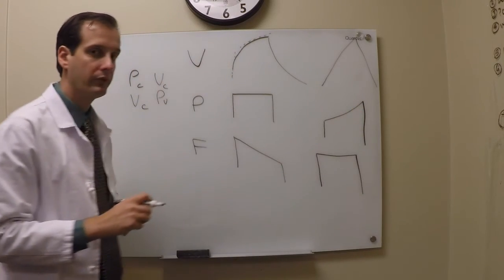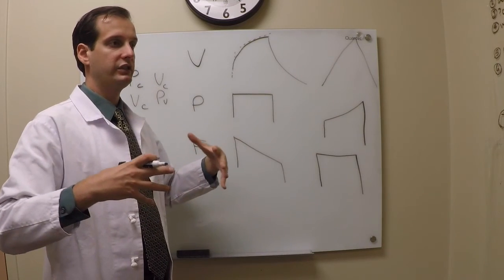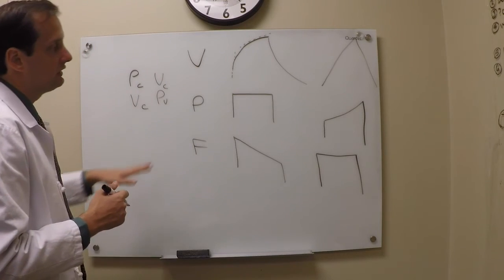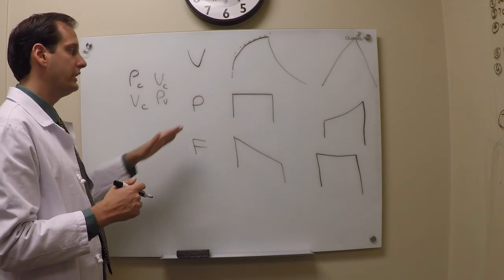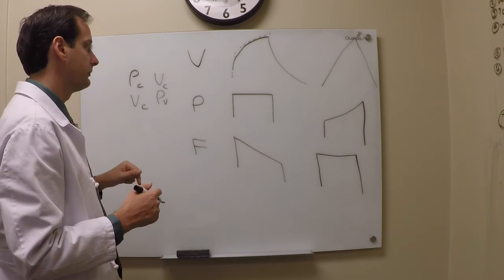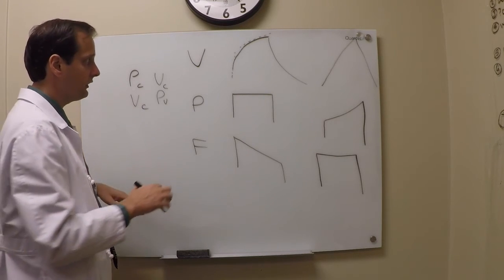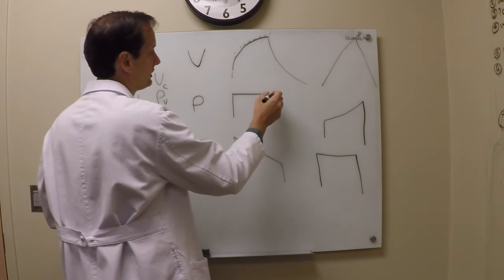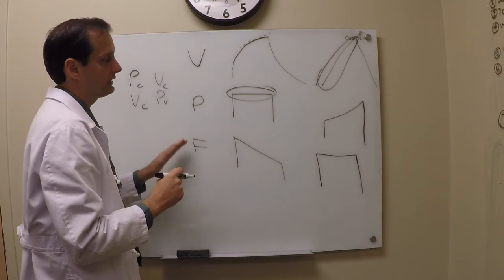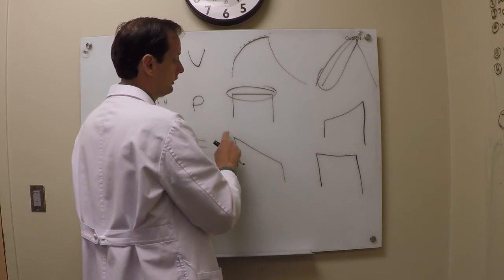And so for that amount of time when the flow is being inspired, you should have a relatively straight volume curve. And what you're going to find is that your pressure will go up as this volume enters the chest, and the chest expands and runs out of room. So these are stylized, and there are different ways of modifying how they're delivered if you want an ascending or descending curve. But for the basics, just understand that depending on which one you held constant, it's going to affect how your flow appears. Is your flow going to be constant? Is your flow going to be variable?